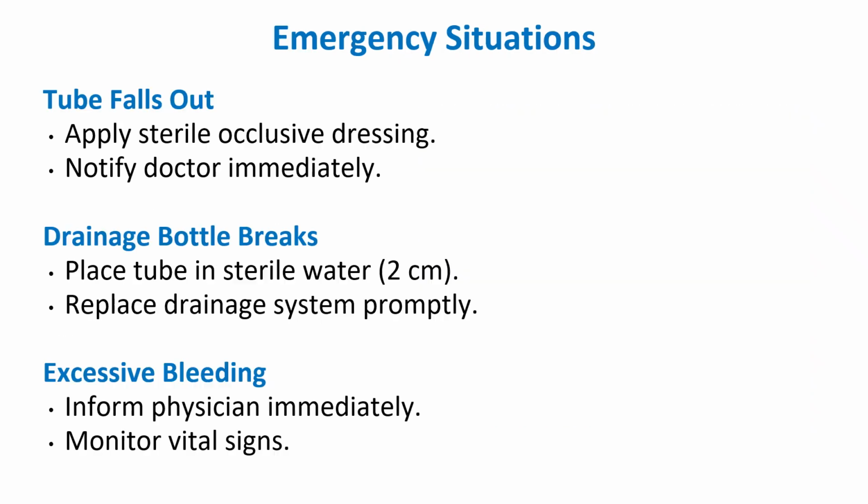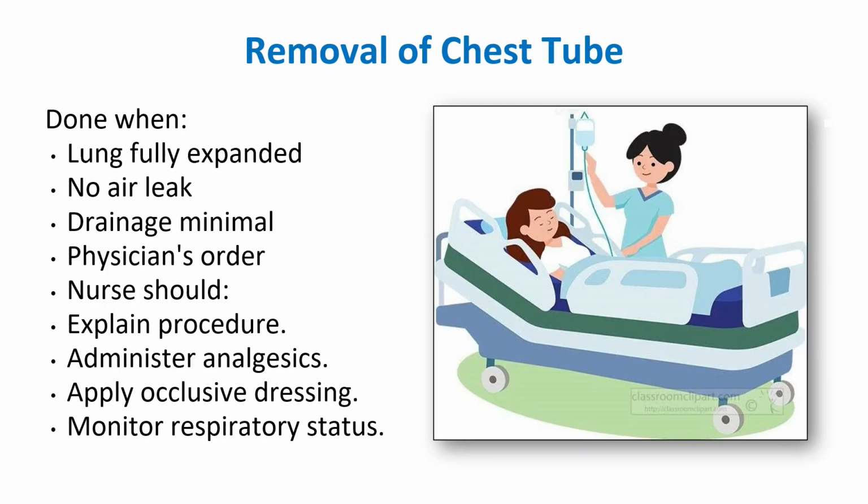Infection. If you follow any unsterile technique, there are definitely chances for infection complications. So you need to be very, very careful.